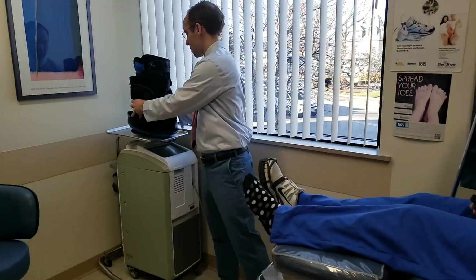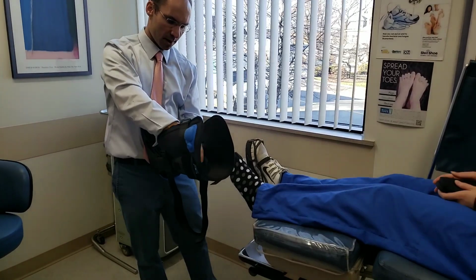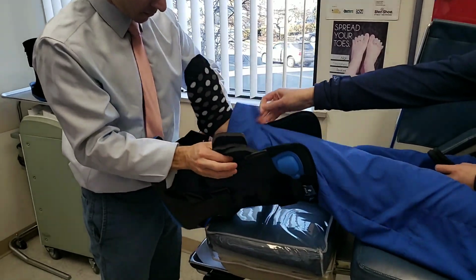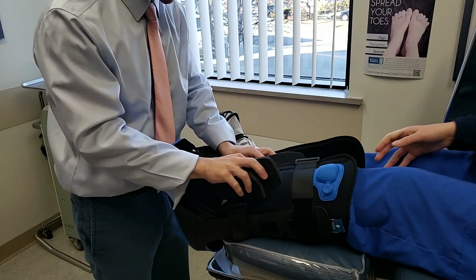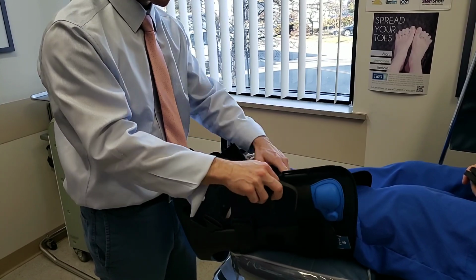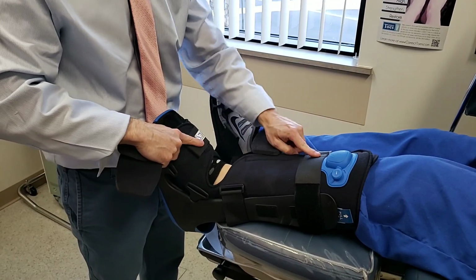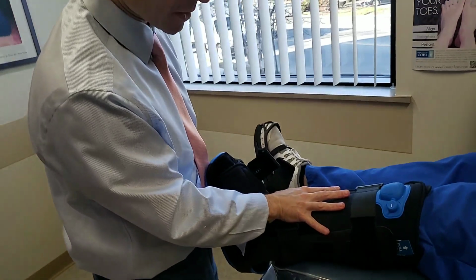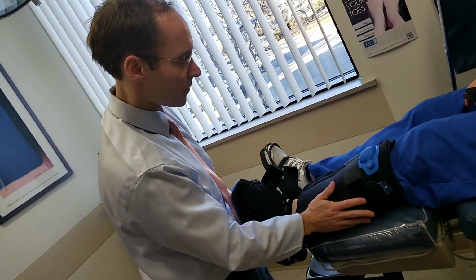And then I just want to show a little bit how the larger one works, you can see the difference in the size. Now, no one usually likes to wear these, but these really help if you're having bigger tendon problems. So you set the foot inside, you put the sock on, and once again it has some of this padding right here. This can be used to protect the foot if needed. The only difference here is it has more straps on it, and it goes all the way up, and it'll protect and help these tendons to relax. Once you're done, it has this little Velcro strap you can pull so it'll stick, and then you walk around.